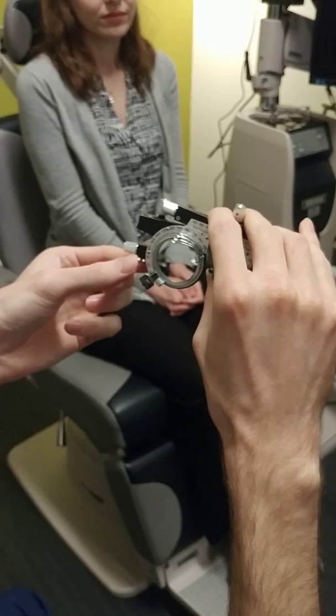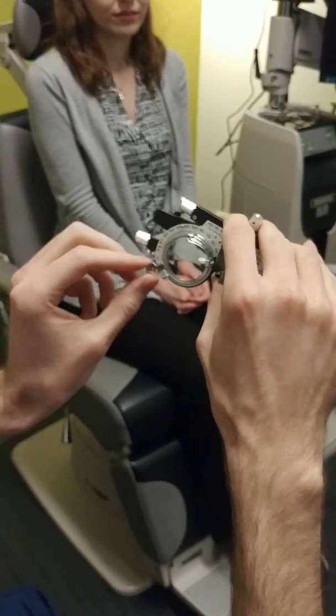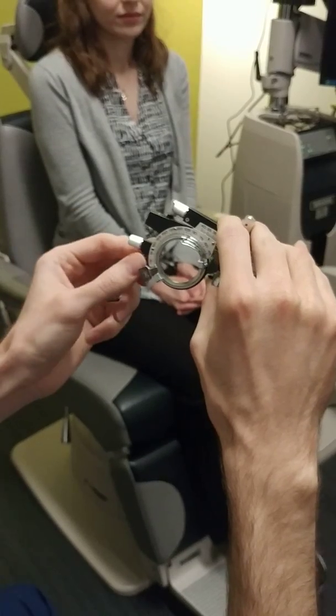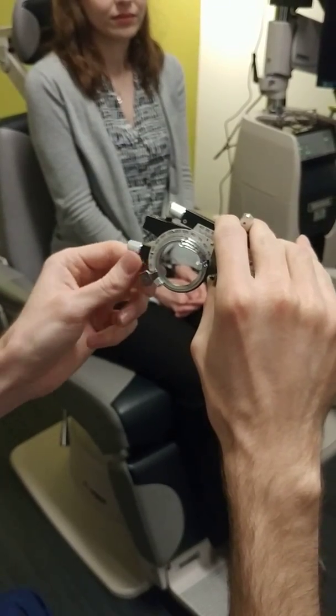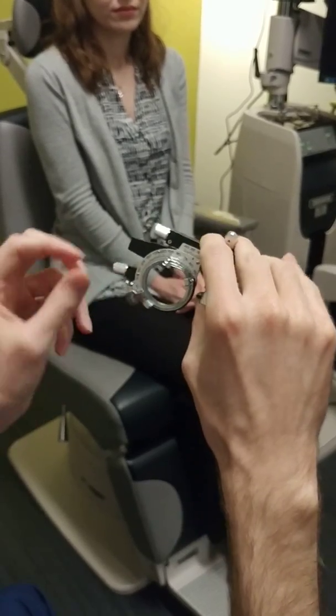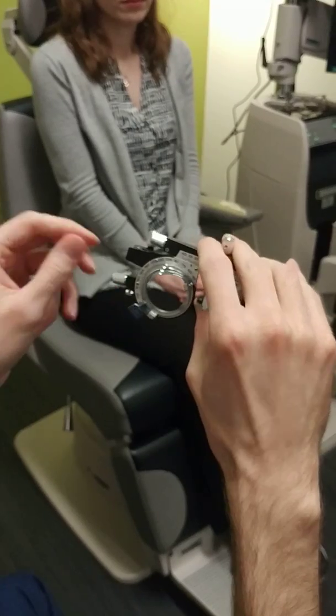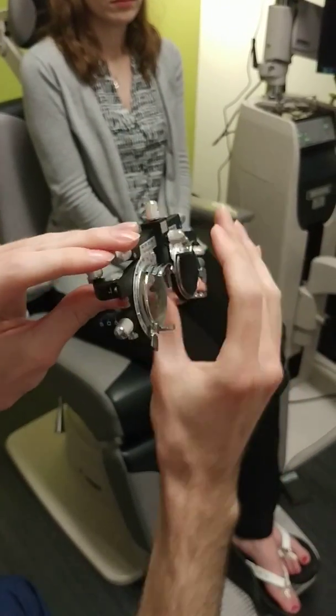Once tightened, if I try to move it, it's a lot more difficult — it won't move. Whereas if I unscrew it, I can move it. So that's what the axis lock is for. Obviously this spinning part is for setting the axis. You want to make sure you actually do get the lens in on the tracks.